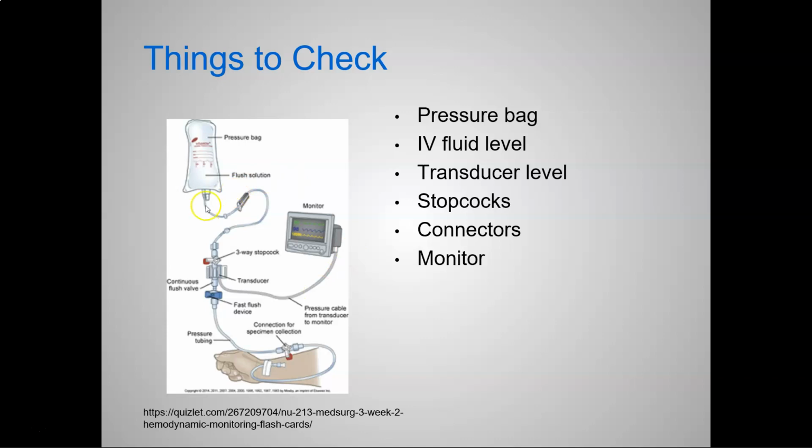Here's the full setup, and you will see this in the ICU. This isn't a maybe, it's absolute. I guarantee you right now, if you go into Desert Valley, St. Mary's, San Antonio, there are patients currently sitting in their ICUs with this exact setup. Please go look at it. Familiarize yourself. Do not touch it, unless you are with a nurse and the nurse is observing you, talking to you about it, and teaching you.